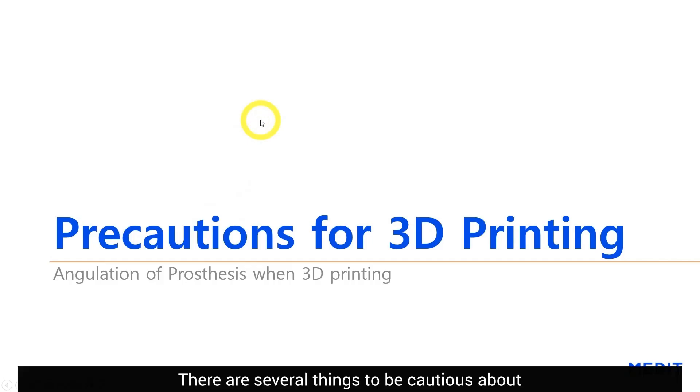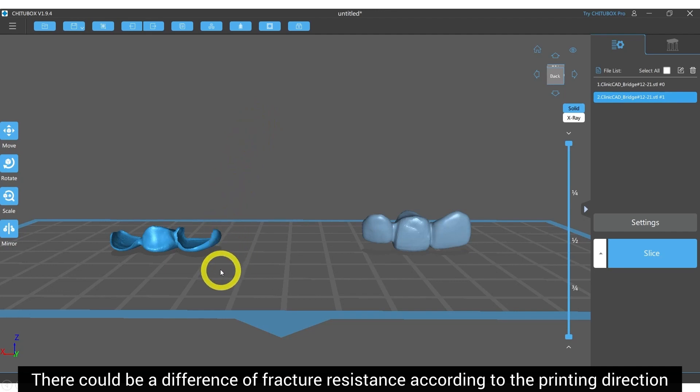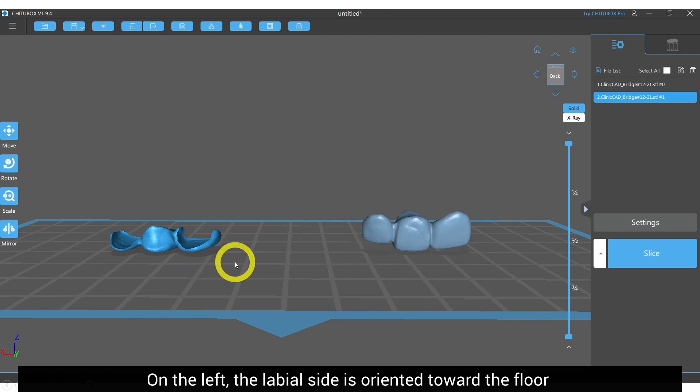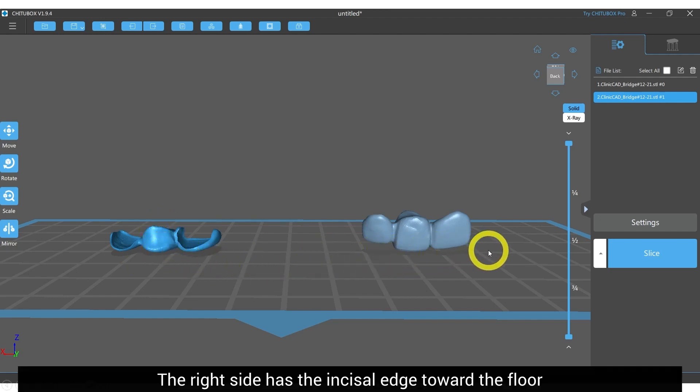There are several things to be cautious about. There could be a difference of fracture resistance according to the printing direction. On the left, the labial side is oriented toward the floor to minimize the height of the output. The right side has the incisal edge toward the floor.